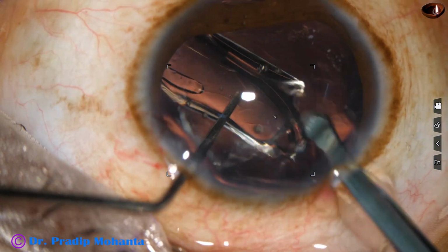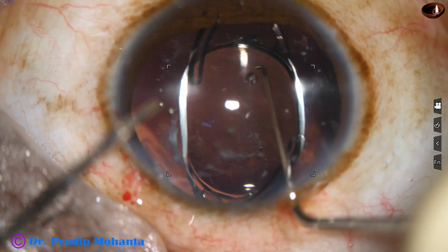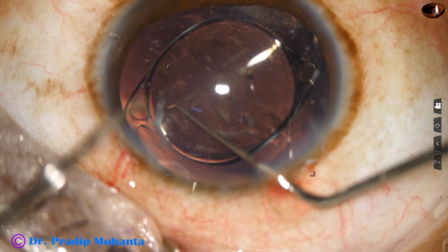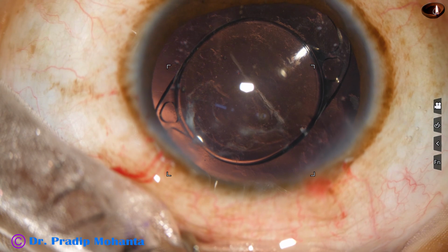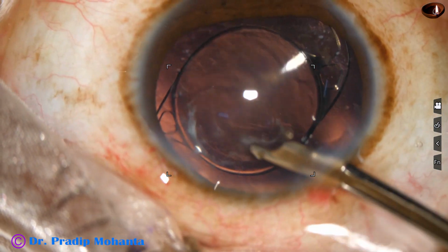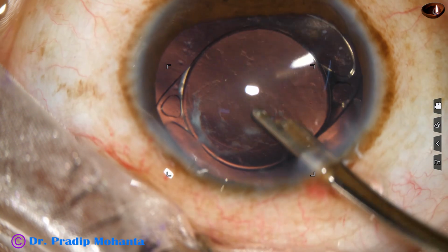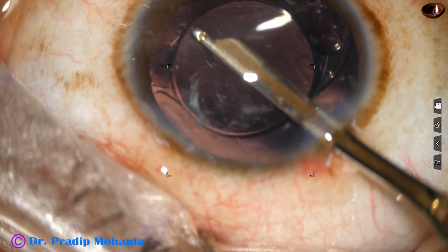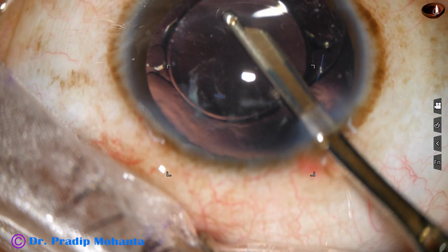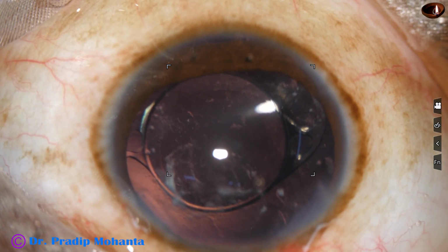The bag is filled up with visco and a hydrophobic acrylic single piece monofocal intraocular lens is placed in the capsular bag. This is a lens from Bausch and Lomb. The name of the lens is Envista. The company claims that it is a glistening free intraocular lens, and I think it is true because I am using it for many years and I have not seen glistening in this lens. And now we are towards the end of the surgery.